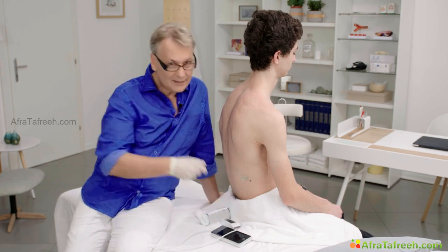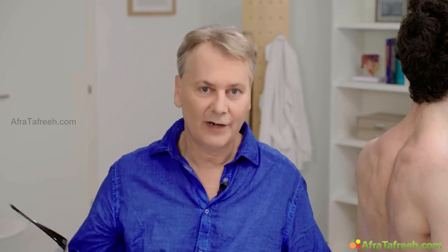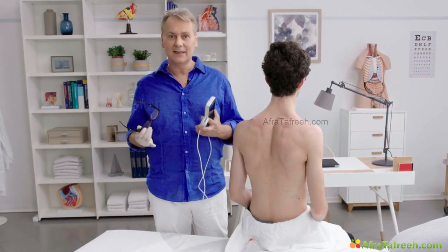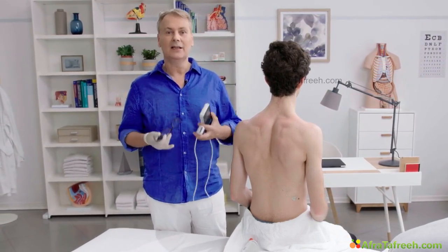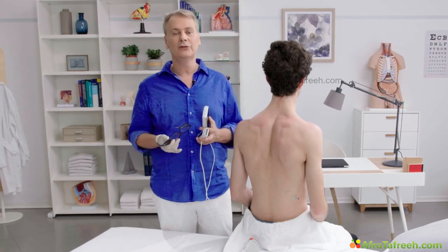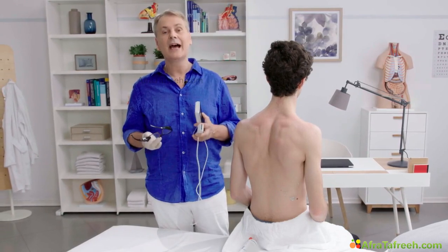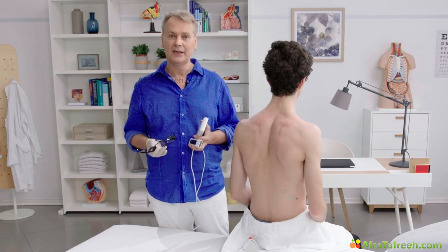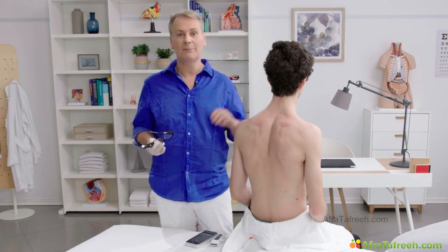So you see, it's not very difficult to really detect even a small pleural effusion. A few final tips. If you image a patient, do not forget that you have to increase the gain so that you do not mistake a dropout for a pleural effusion. Look for the atelectatic lung tissue, which often swims within a pleural effusion. And finally, if you do have a patient where you know he has a pleural effusion, which had been diagnosed previously, take the opportunity and image the patient yourself, because that will make you more confident when you, maybe for the first time, encounter a pleural effusion.